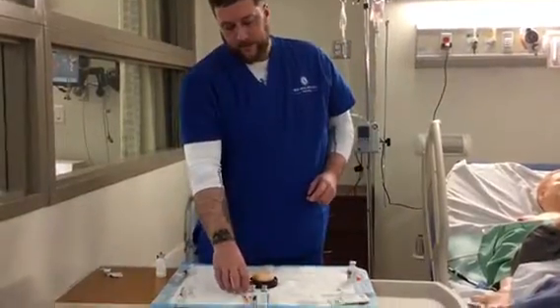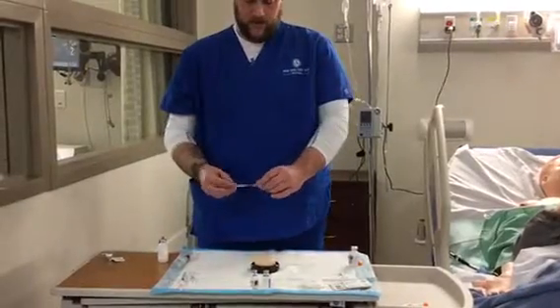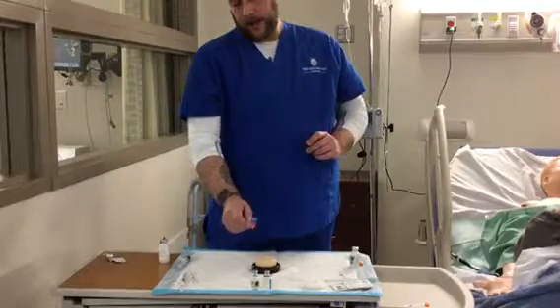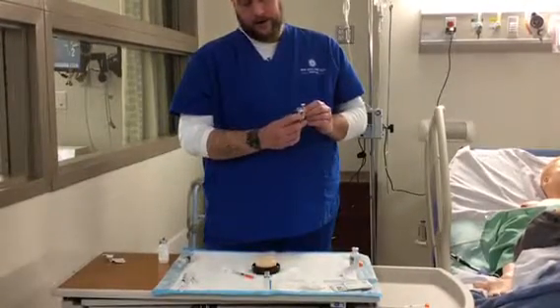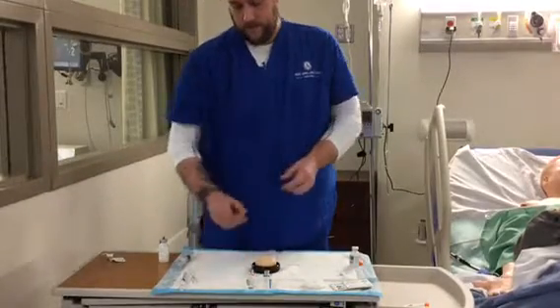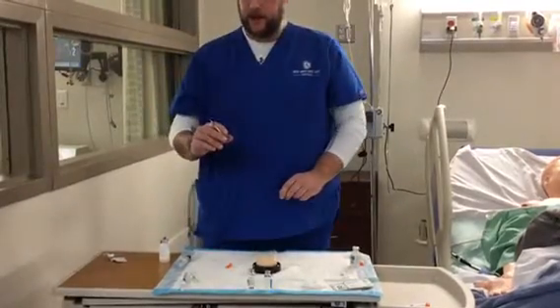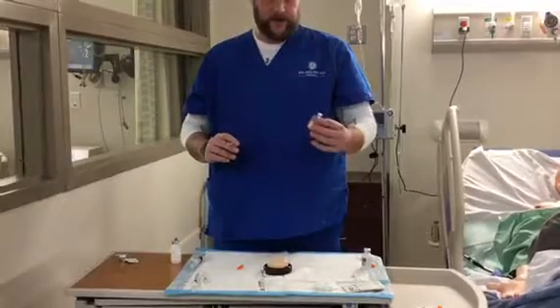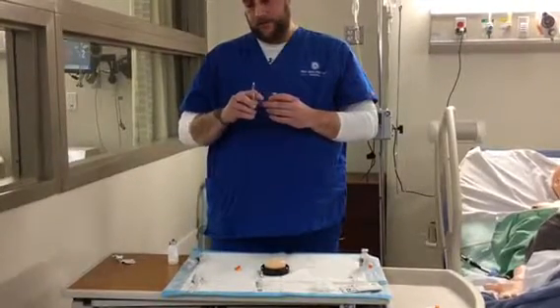For the next, we have the subcutaneous or insulin. For this one here, we're going to do the clear first, and then cloudy. A good way to remember it is the R is for the clear, and we want to become RN. So the same technique goes, except this one we're going to do a little differently. What we're going to do is inject the air into the cloudy first. So we'll do 10 units of each.